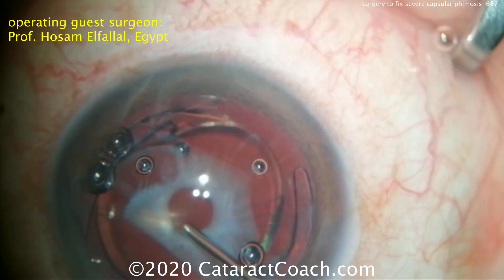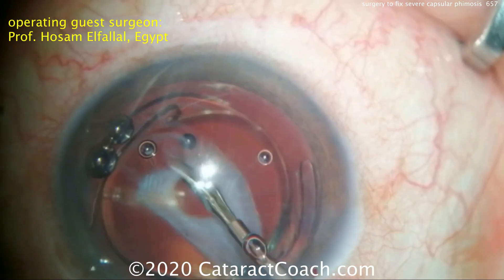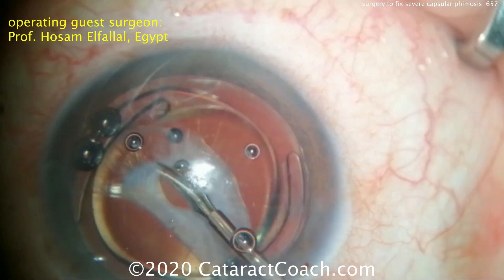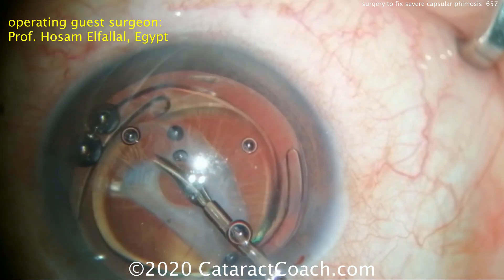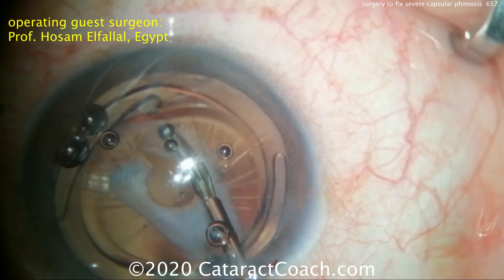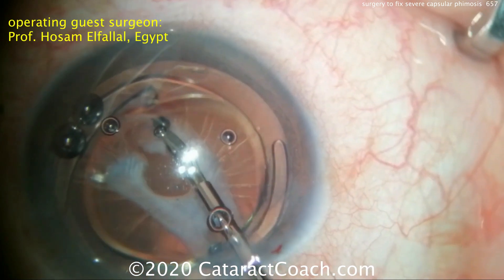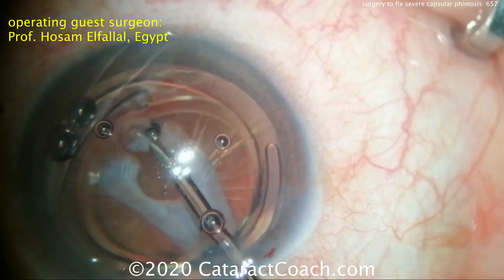This IOL can certainly be saved. The goal here is to cut out this phimotic membrane. Using micro scissors on a 23-gauge shaft, those can be placed in the eye and radial cuts of the anterior capsular phimotic rim can be made. You can make multiple cuts — the membrane can be thick, so it may take a few bites with the scissors to achieve the appropriate cut.